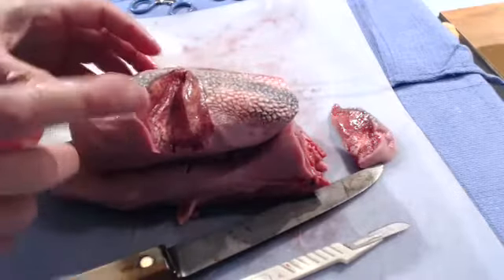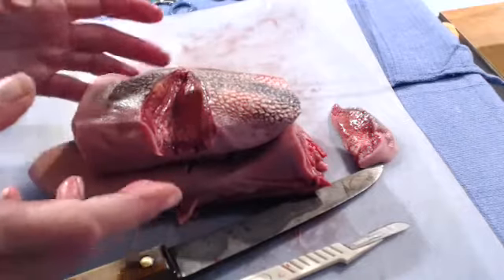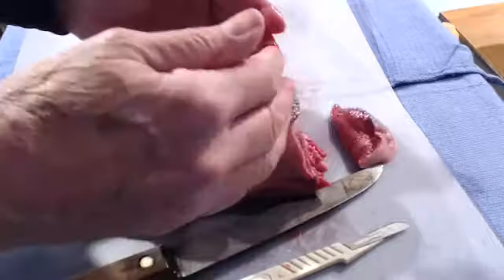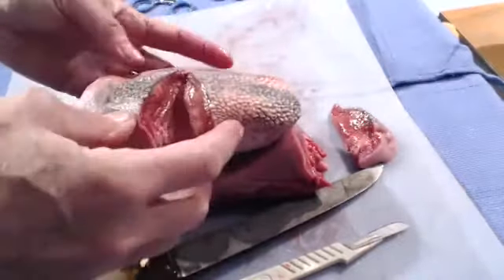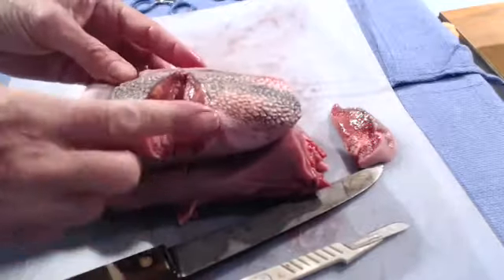So an alternate option with the plain beef roast is to use a piece of stockinette like you use for making baby hats and put one piece over it in each direction so that you have these outer layers that you can use to stitch for the vaginal mucosa and for the perineum.